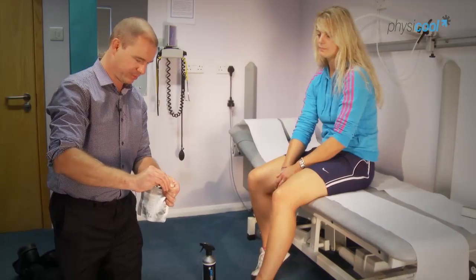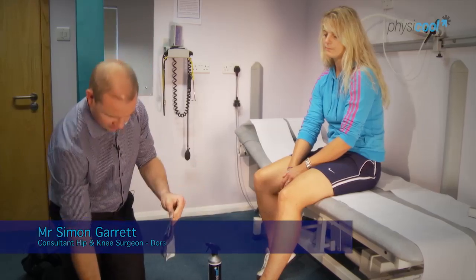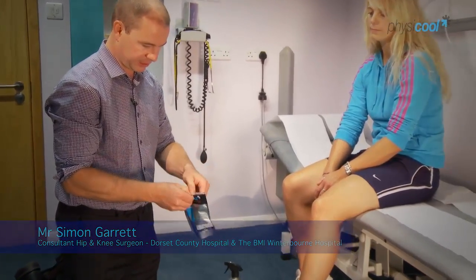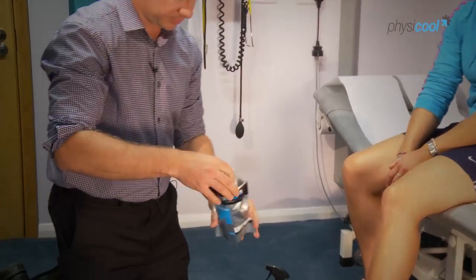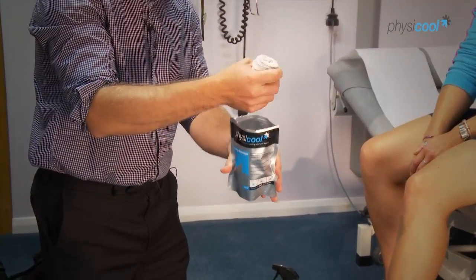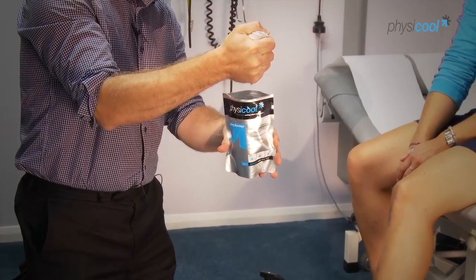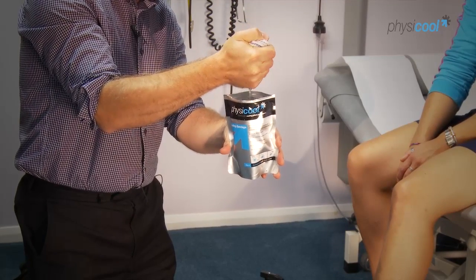I'm just going to demonstrate how to apply the bandage. Tear open the packet — it's a self-sealing mask at the top. The bandage has come out quite damp, which is the cooling liquid, and we just give that a squeeze to make sure it's not too wet as we apply it.